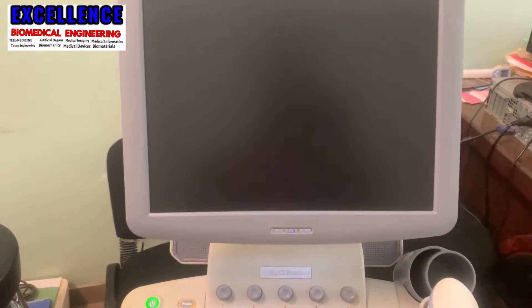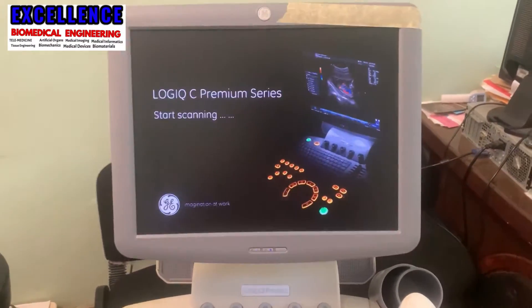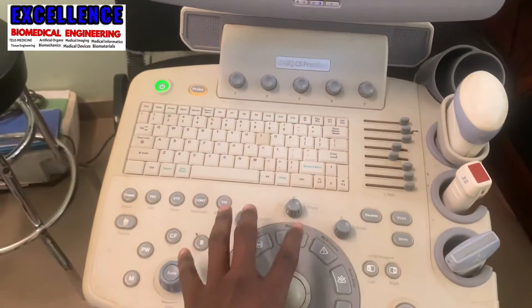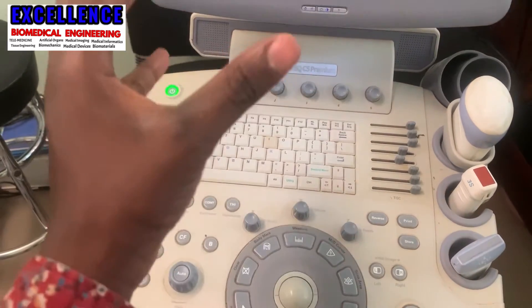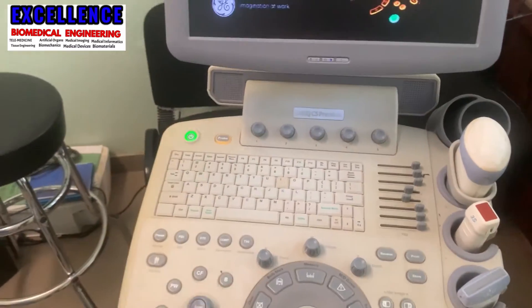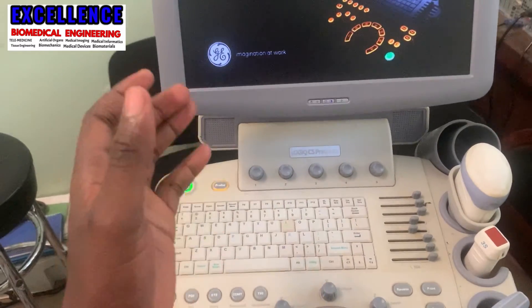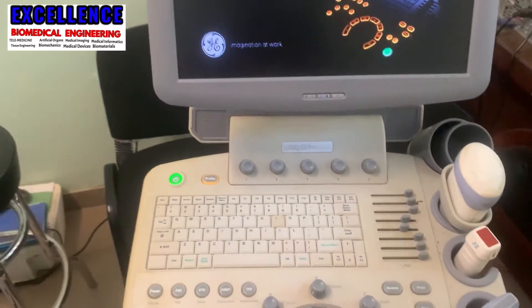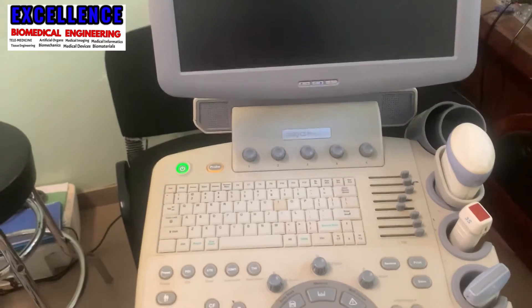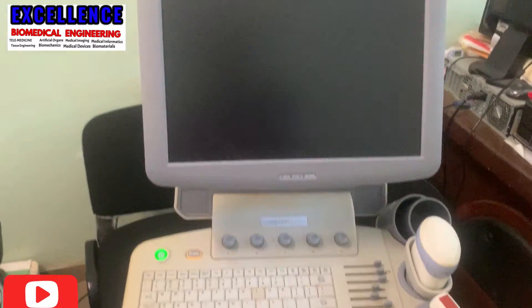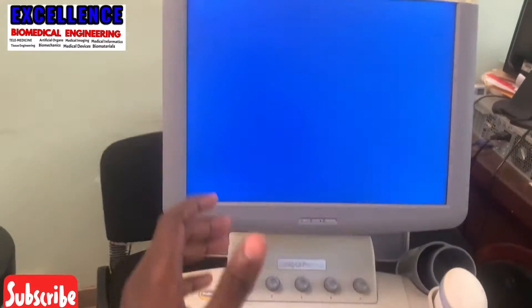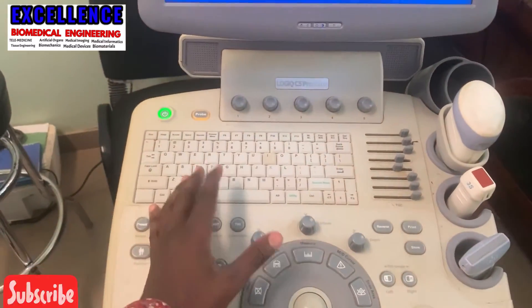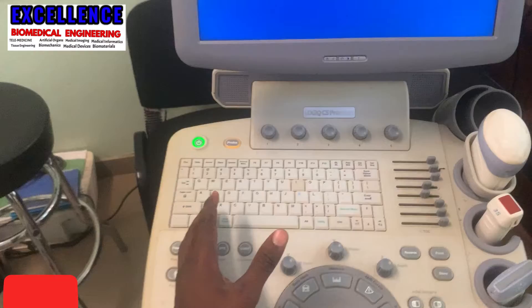Alright guys, today's video I'm going to show you how to set time and date in this Sonoscape Logic C5 Premium. But before I dive into the main topic, I would like to talk about the importance of setting date and time in your ultrasound.